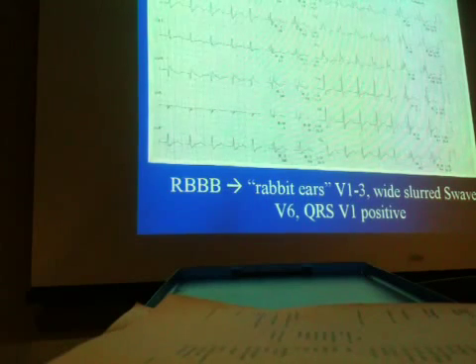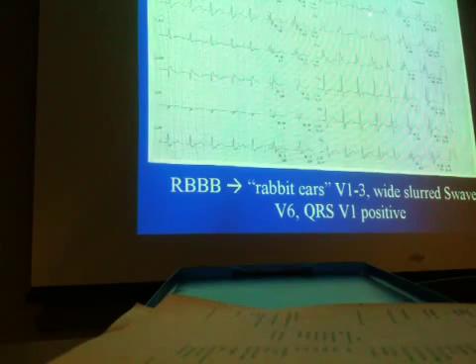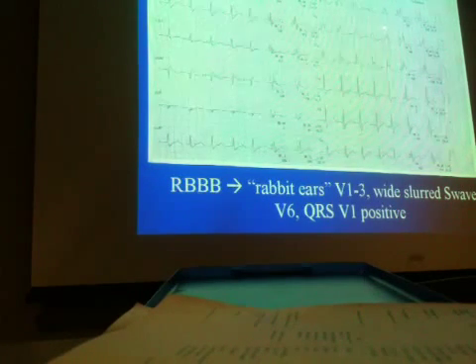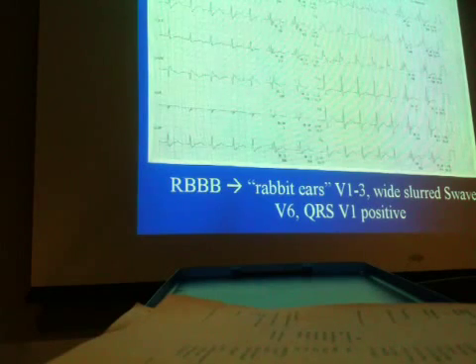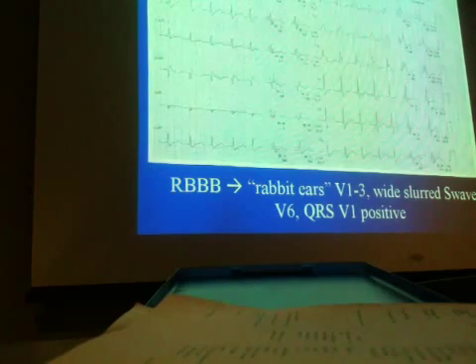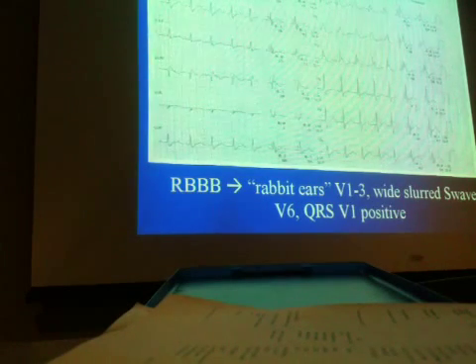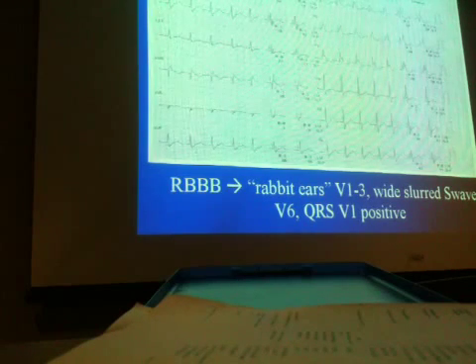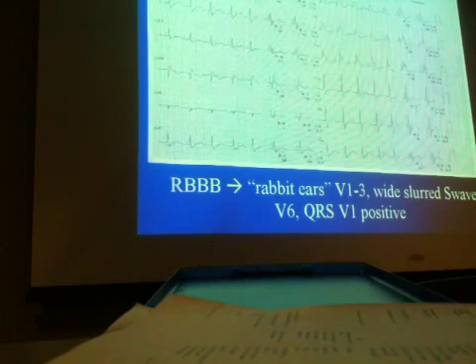Okay. Your QRS is broad. See how this is not a nice single flat line, but it's really broad. Okay. And your QRS, so the R wave is above your isoelectric line. The other thing you have with a right bundle, after you think you got it in V1, you go to V6. And usually, if you look back at all the other EKGs, we may have a little Q wave, we have our R wave going straight up and down, we have an S wave that hugs the QRS. It's very tight and narrow, one little neat package.